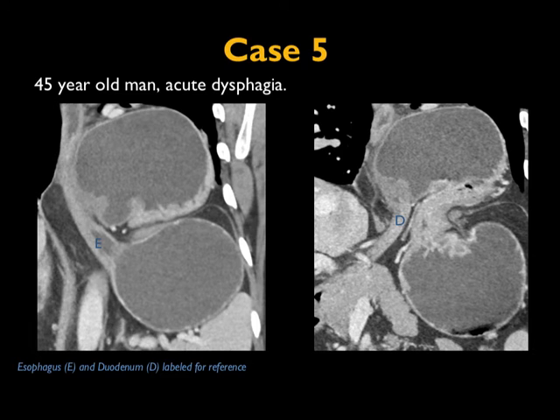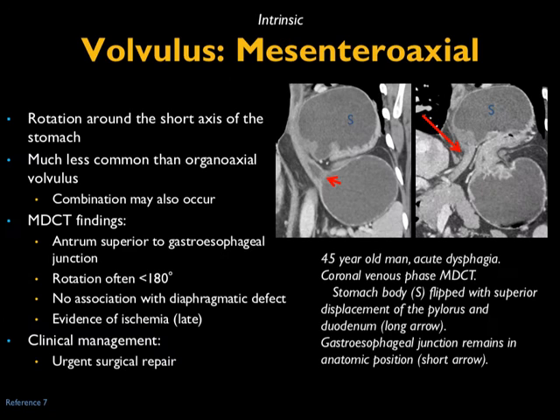Another case with dysphagia — this looks very similar to the last case. Where's the esophagus, where's the duodenum? What you have here is a volvulus, but in the mesentero-axial perspective — rotation around the short axis of the stomach. It's less common than organo-axial volvulus, and you can actually have both combined. The antrum is seen superior to the GE junction. Rotation is usually under 180 degrees and is not associated with a diaphragmatic defect. Evidence of ischemia can be present but is late. As with all gastric volvulus, surgery is mandated.